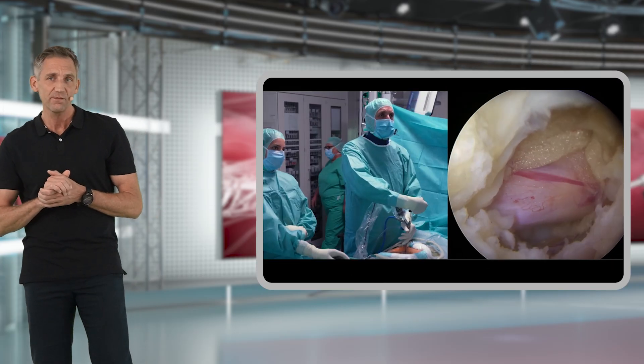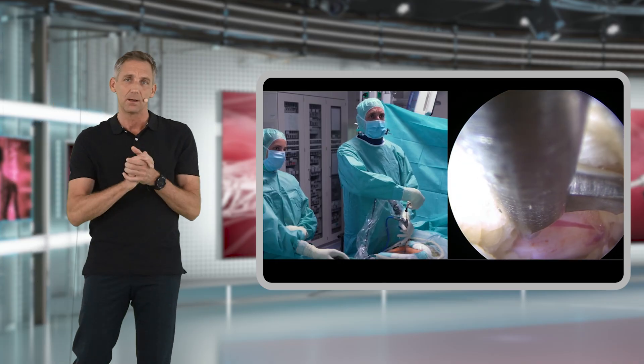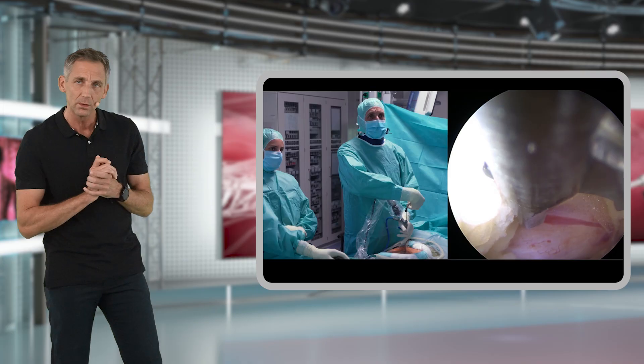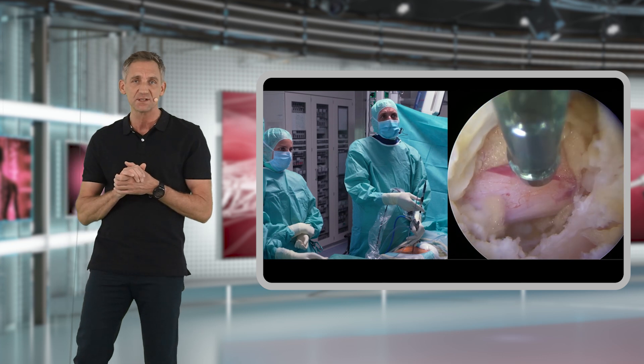Later on in your learning curve, when targeting a disc herniation or sequester, in the majority of cases you can create a really tiny — maybe only two to three millimeter — hole in the yellow ligament, just enough to get into the spinal canal and right over the disc herniation.